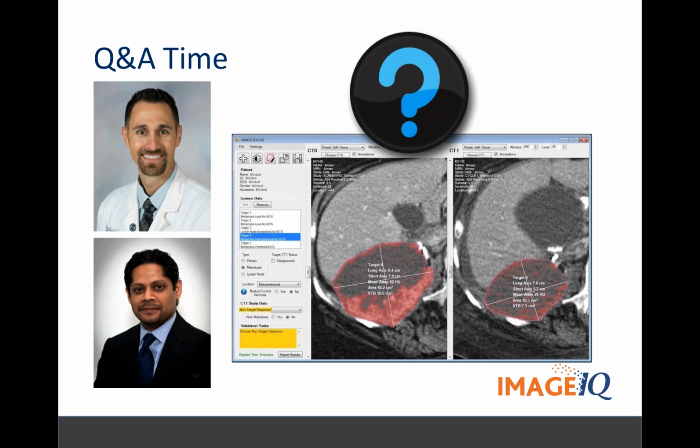I think back on the question of whether this can be done real time too. Think about what you're doing real time when you don't have software like this. Someone's having to quality check all that. Even after your radiologist does it, that radiologist is not calling up someone centrally on the phone and telling them this is progressive disease or not, or whatever the answer may be. Someone has to go through and quality check that, make sure nothing was forgotten, all the data points are correct, decimal points are where they're supposed to be. You don't have to do that with eMass. It does that for you. So it's much more amenable to real time than probably anything else in existence at the moment.